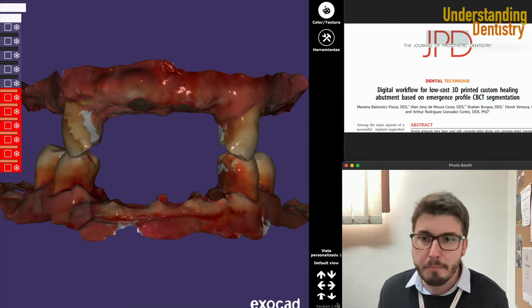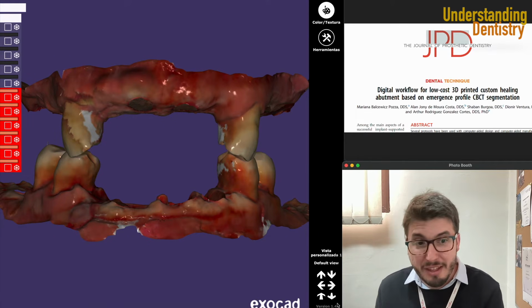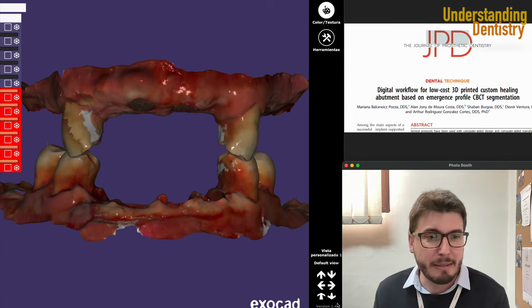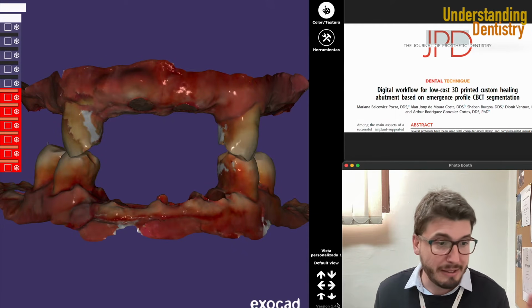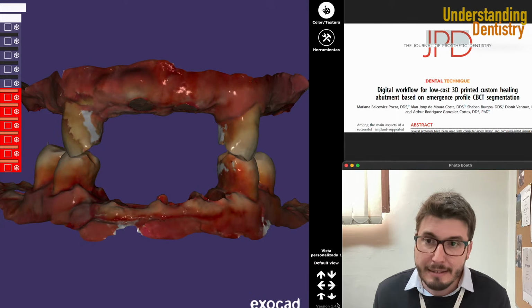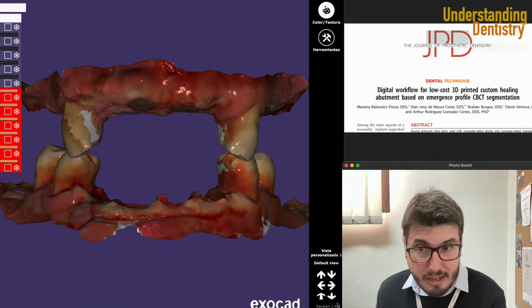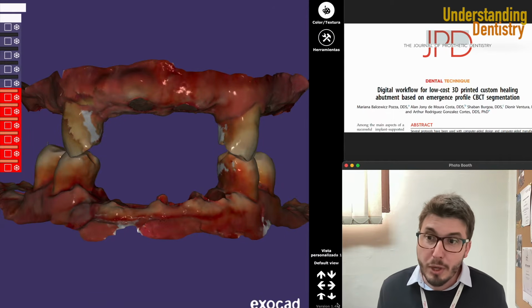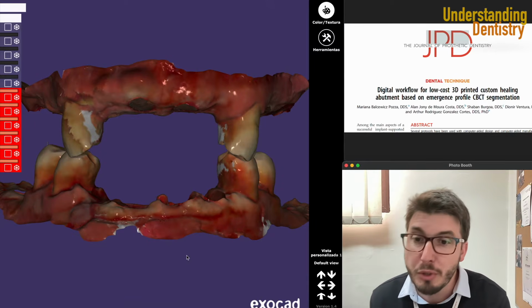We already did perio. Of course, you need to see which teeth you can still save, and then you would do perio. Before that, even the medical history, the dental history, the clinical examination. And then, considering that everything was fine, this is your situation. So you decided to save these teeth here. You are seeing that the canines are here, and what advantage do we have from this situation? So what should you do now?